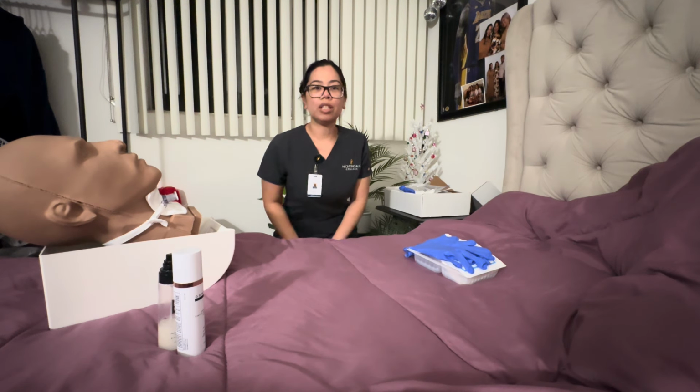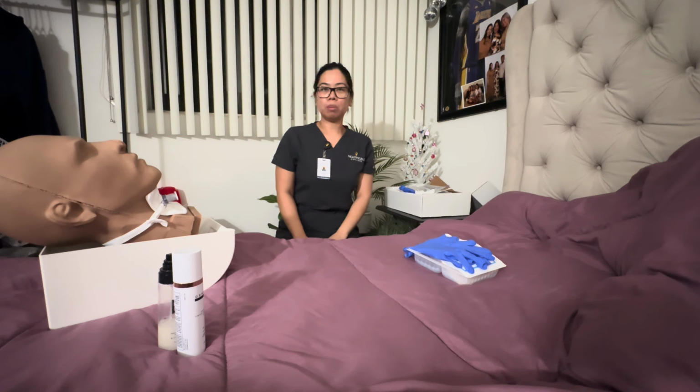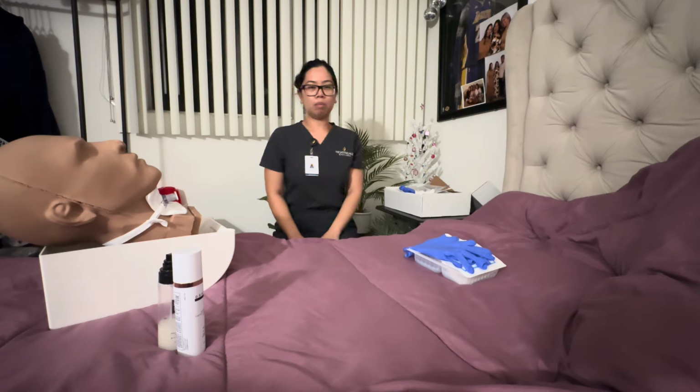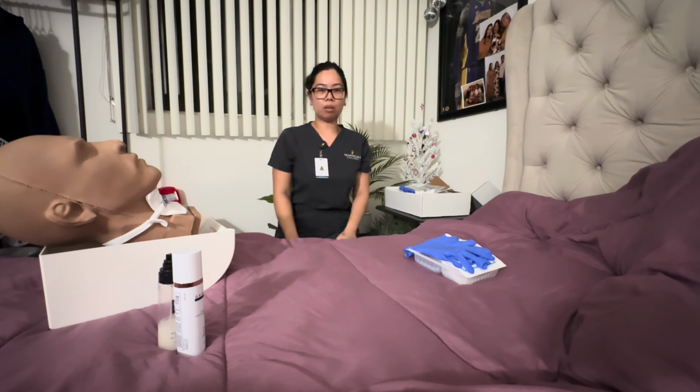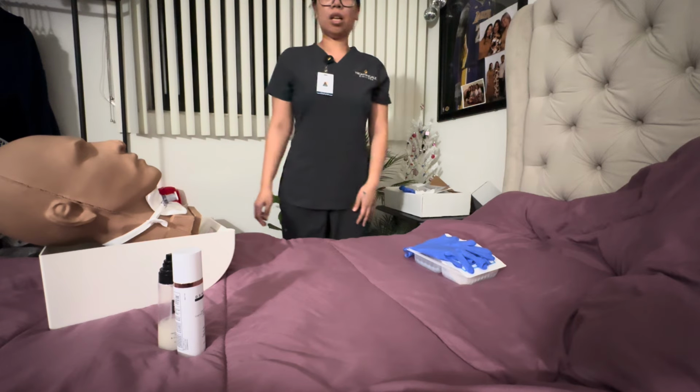My name is Gina Gray and I'm going to do the tracheostomy care video. Just for the purposes of this video, I have a low working space, so I'm just going to use a chair. So when I stand up.